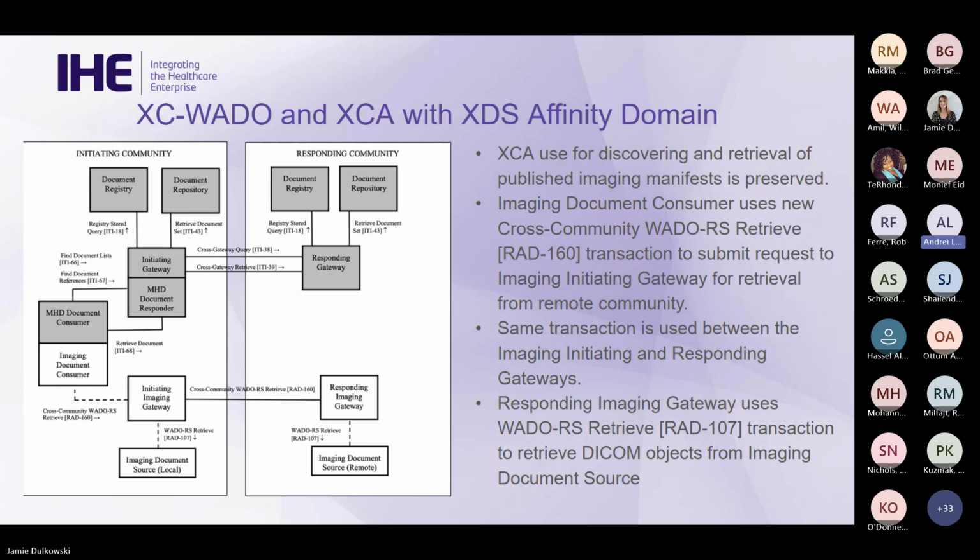However, in XC-WADO, we are seeing the imaging document consumer using the new cross-community WADO RS retrieve RAD 160 transaction to submit the requests to imaging initiating gateway for retrieval from the remote community. And the same transaction is used by the initiating imaging gateway to communicate with the responding gateway.